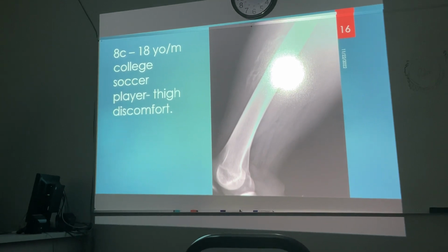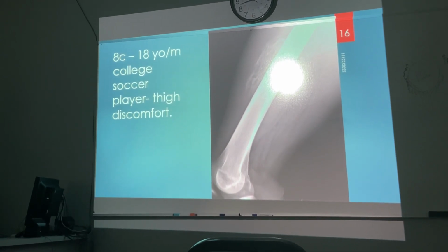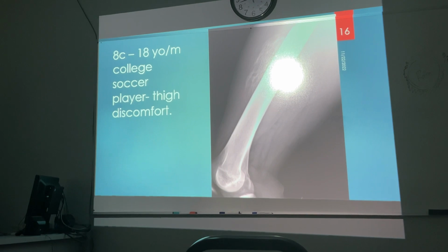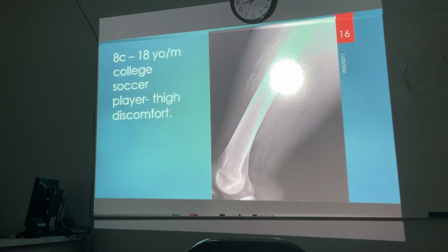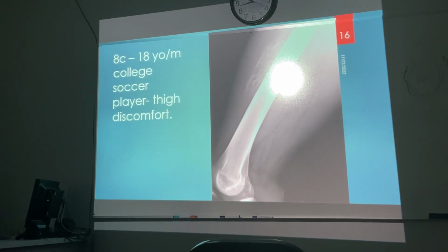Okay, I think we changed this a little bit, but the idea is, there's density where there shouldn't be density. You don't know whether this is truly attached. Get the cross-sectional imaging. It's either a soft tissue tumor, could be a bony tumor that is extending from this cortex into it, or is it just myositis ossificans, heterotopic bony ossification? That should have a history of trauma. The football helmet into the quad, that makes sense. Then that radiographic picture fits. No history of trauma, rule out something aggressive, either bone related or within the soft tissues.